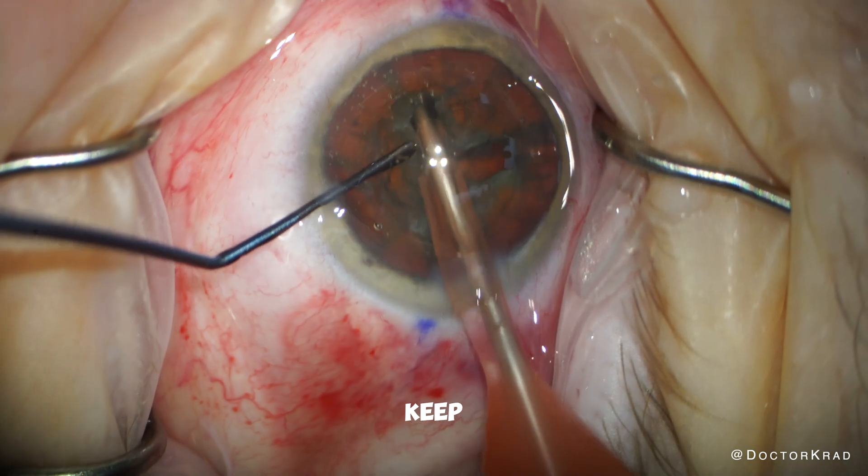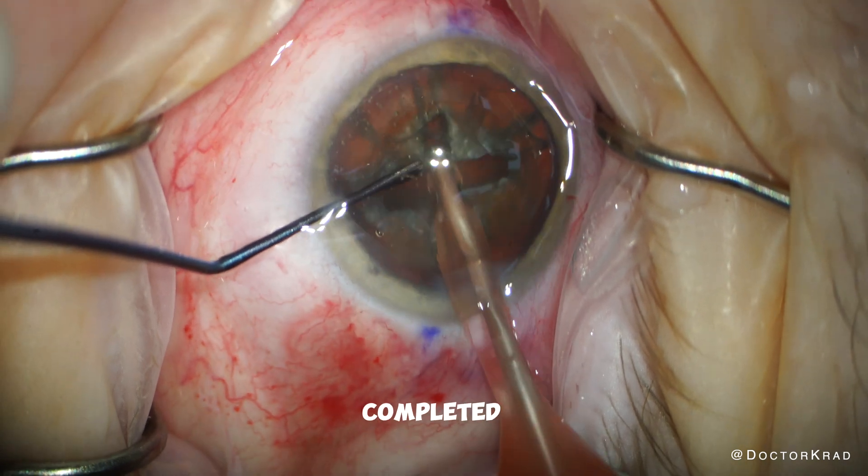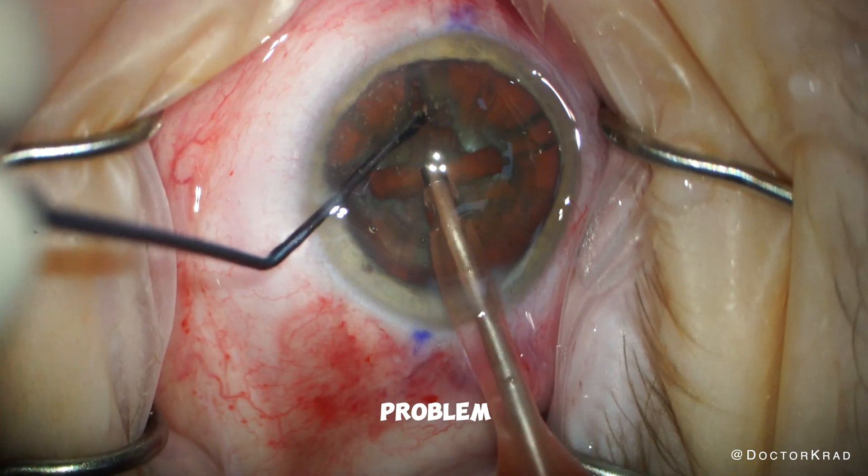It's a good thing lasers keep getting faster and faster. This is important because the more quickly the laser procedure is completed, there is less time for a problem to occur.